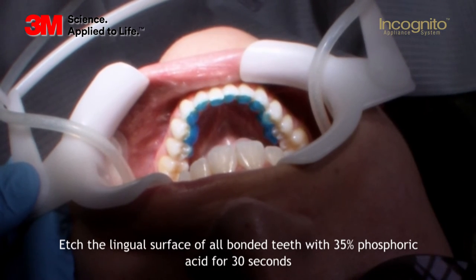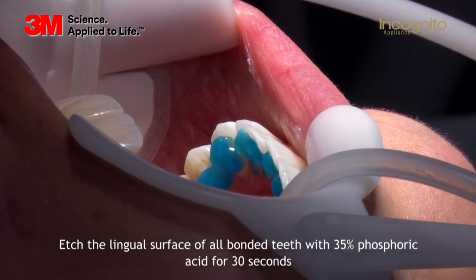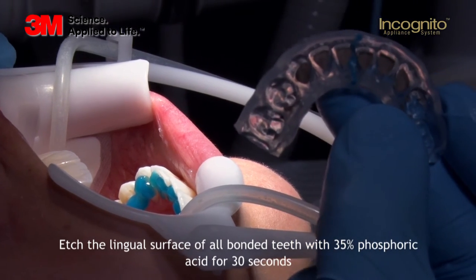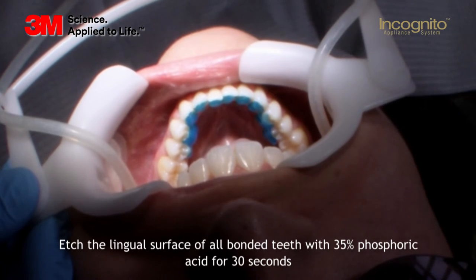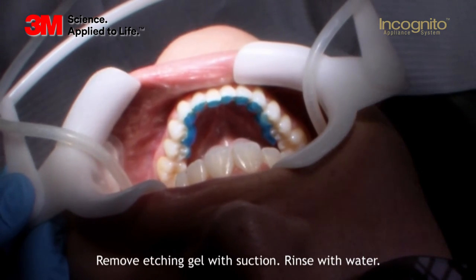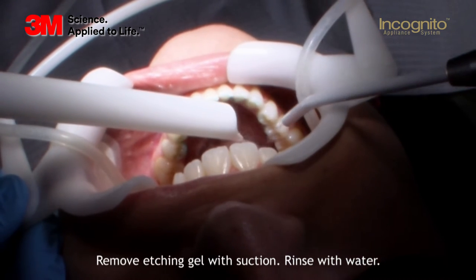You should etch every surface for 30 seconds. While you etch the surfaces, if you want to be more efficient, you have the option to already apply the bonding in the bracket base — I will show you that in a second. After 30 seconds of applying the etching on the tooth surface, you will remove the etching and rinse thoroughly with water.